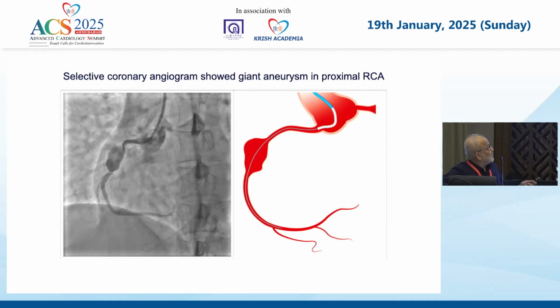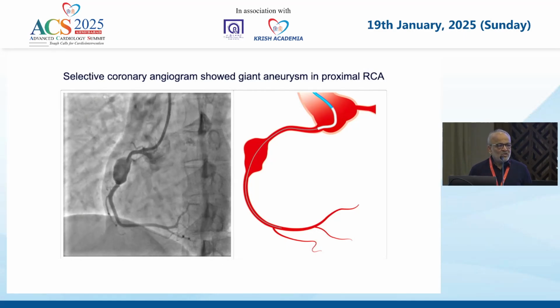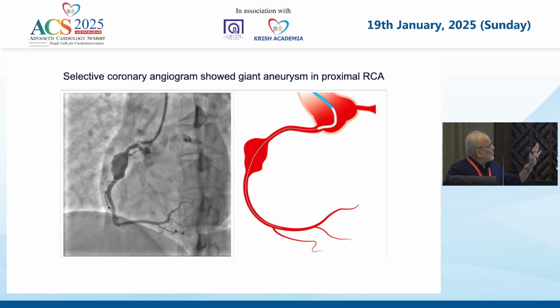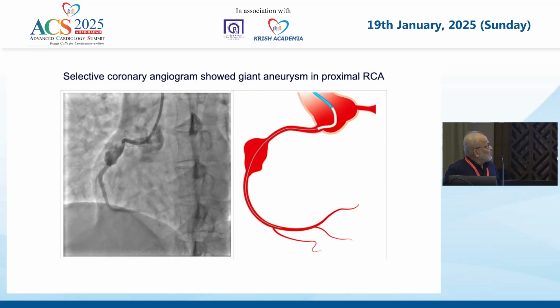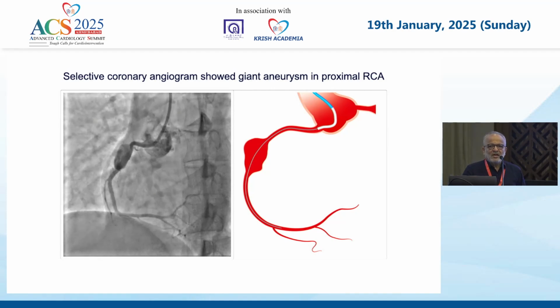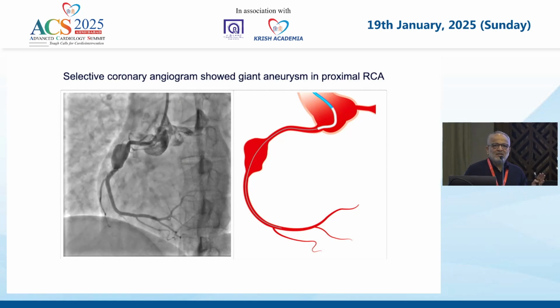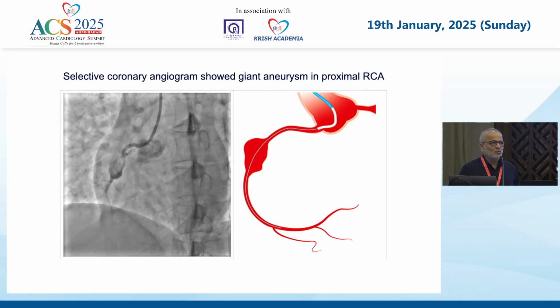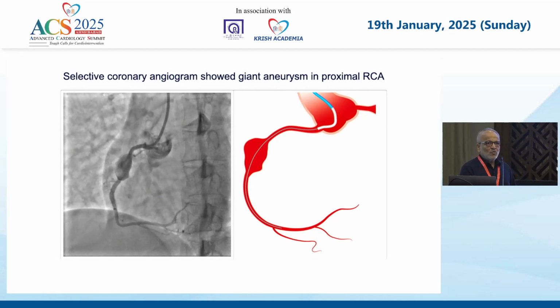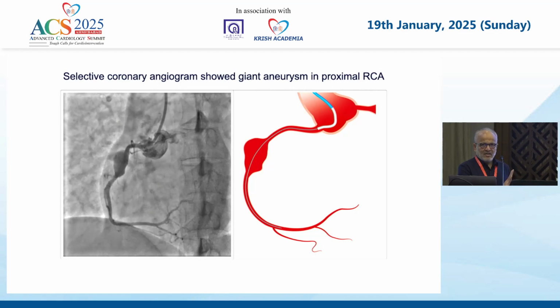And see, this is what it is: a huge aneurysm with impending rupture. There must be a good amount of clot inside too. When we measured the size of the aneurysm, it was almost 29-30 millimeters. And the longest Papyrus stent available was 26. What to do? We thought over it. You cannot overlap two covered stents. We gave the option of a covered stent under image guidance.